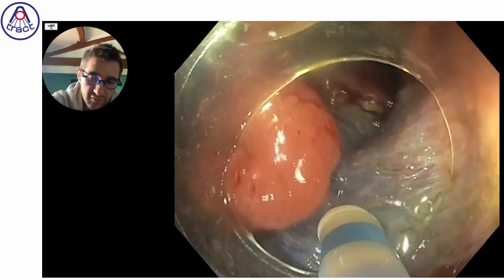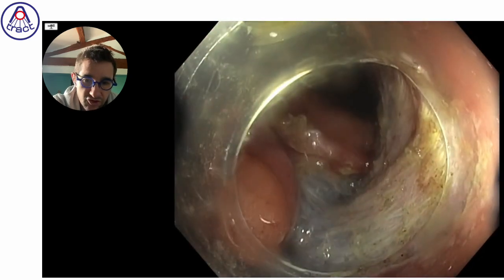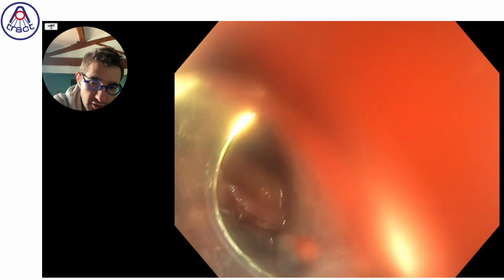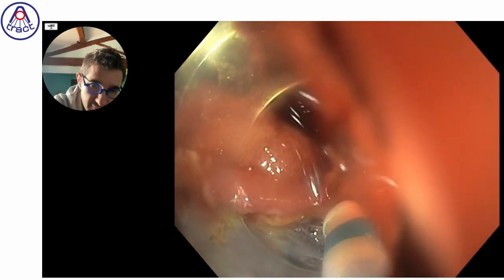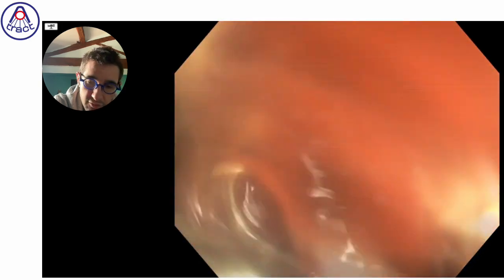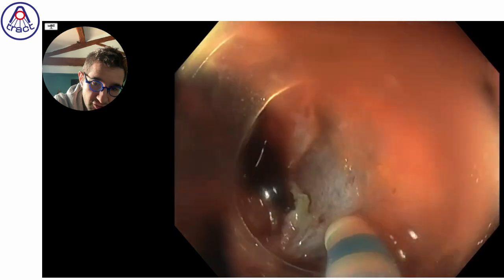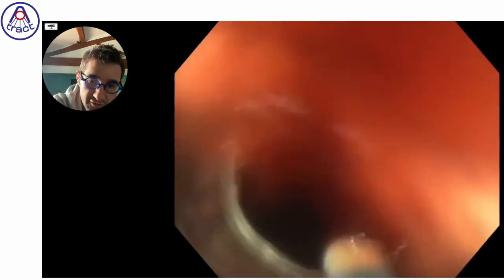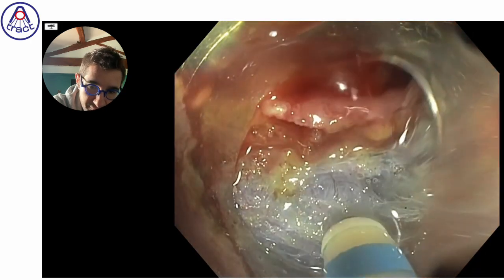And once the space is large enough, we will go under the lesion in order to have a better exposure of the area. But for this, you should probably deflate. So I decide to go on the right, sorry, and to cut the fibers that are fixing the edge of the lesion, going to the circumferential incision groove, in order to open the space.